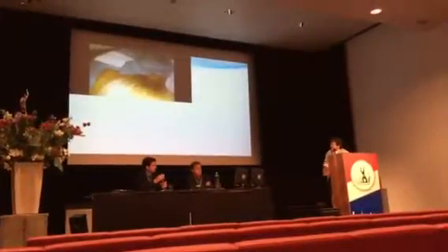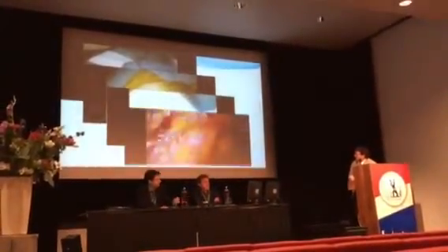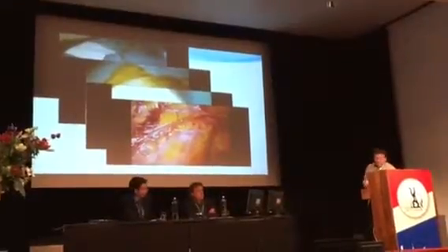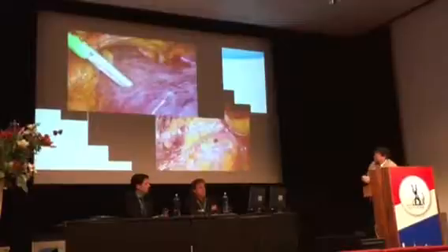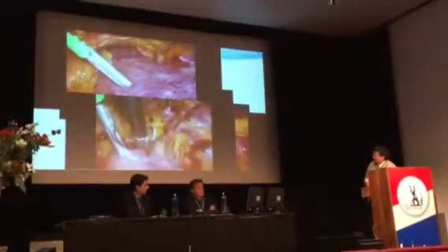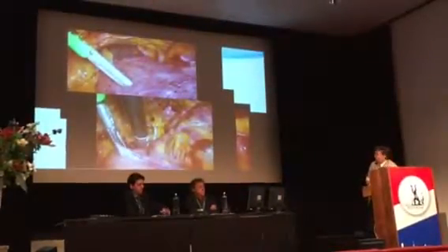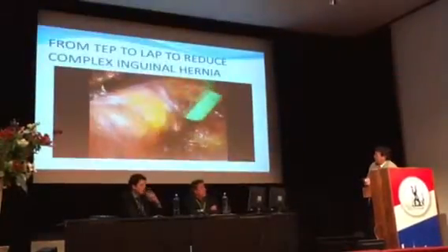When you find a huge inguinal hernia which does not reduce after general anesthesia, and you perform the TEP exploration and find a very large hernia which cannot be reduced, you have to avoid creating pneumoperitoneum, which will prevent the TEP procedure and may lead to a large peritoneal tear, which may make TEP impossible.